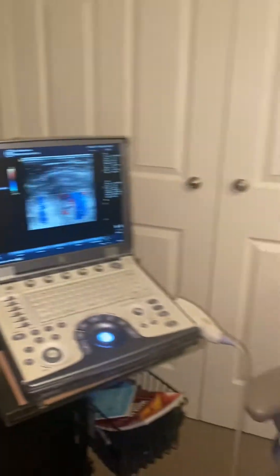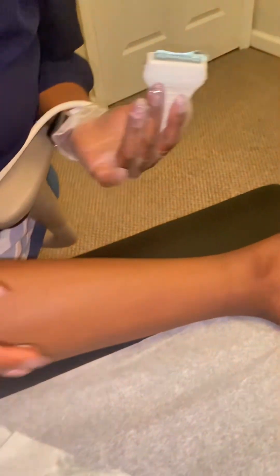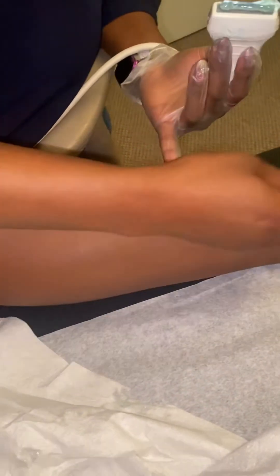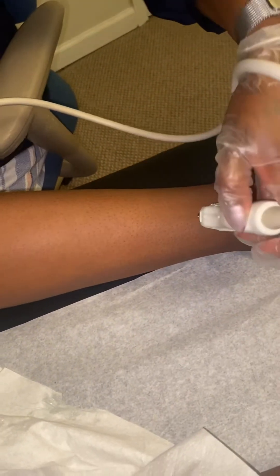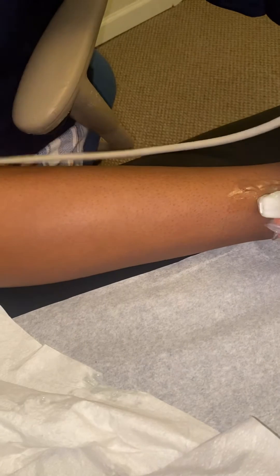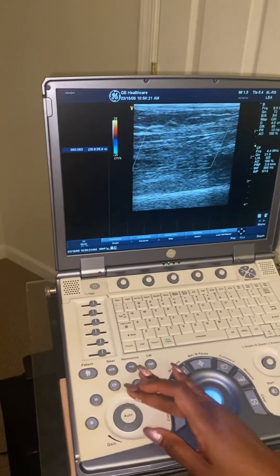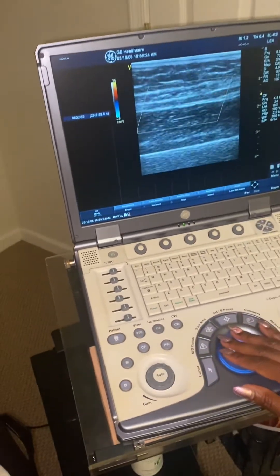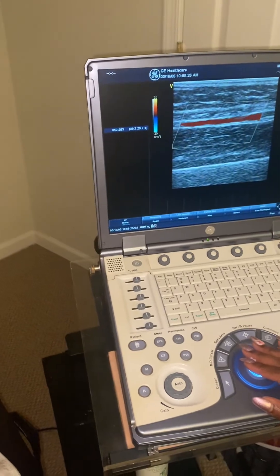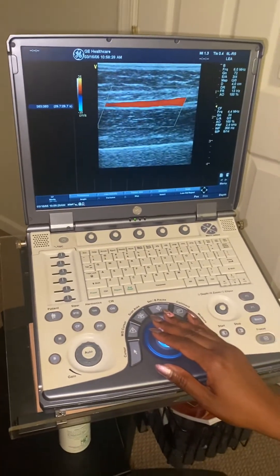Another trick to getting the posterior tibial as well is you want to take a look at the calf. You're looking at the image right at the center of the calf. Usually when I do my posterior tibial, I like to start at the distal segment — because usually at that segment the vessel is quite superficial and it's much easier to see. You can see it right there at the distal calf.